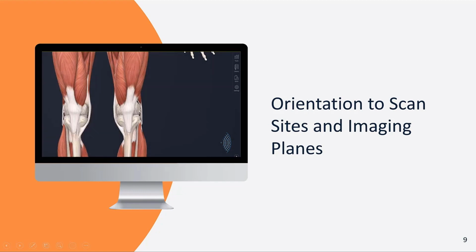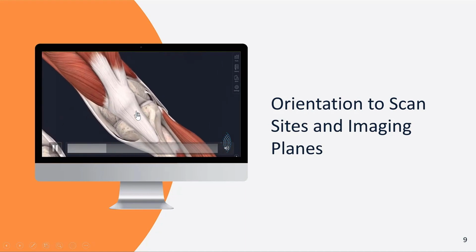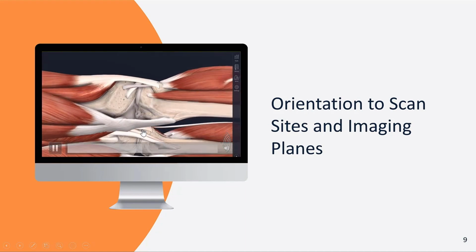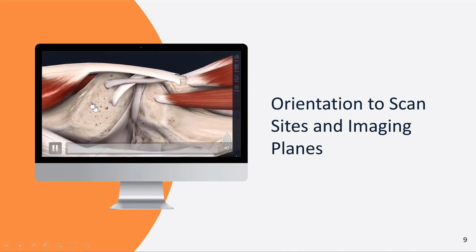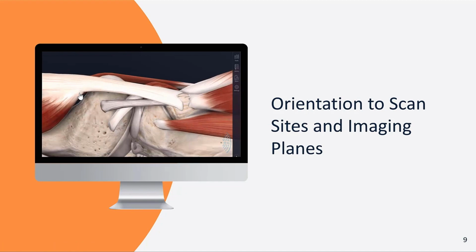This video you're going to be watching now basically shows a highlight of the region where she was having pain, and it's going to bring that image closer to you and expose the structures of support that are underneath the zone where she had most of her discomfort. You're going to see here that this is the lateral meniscus.